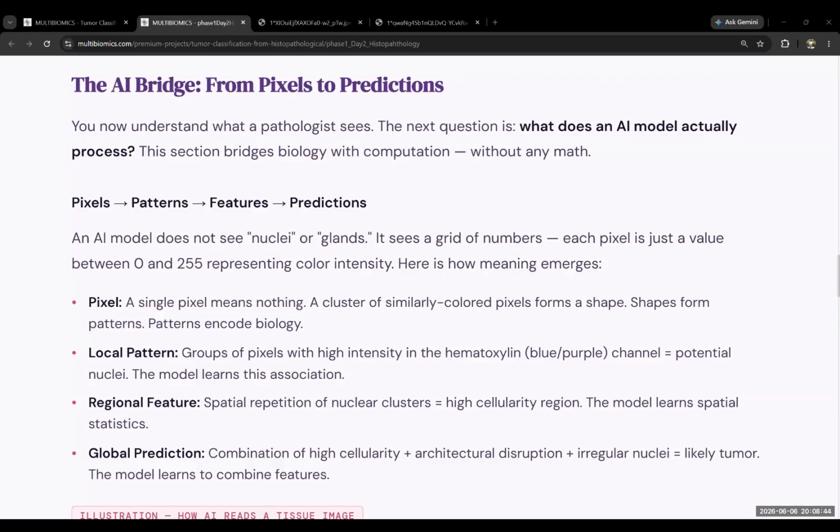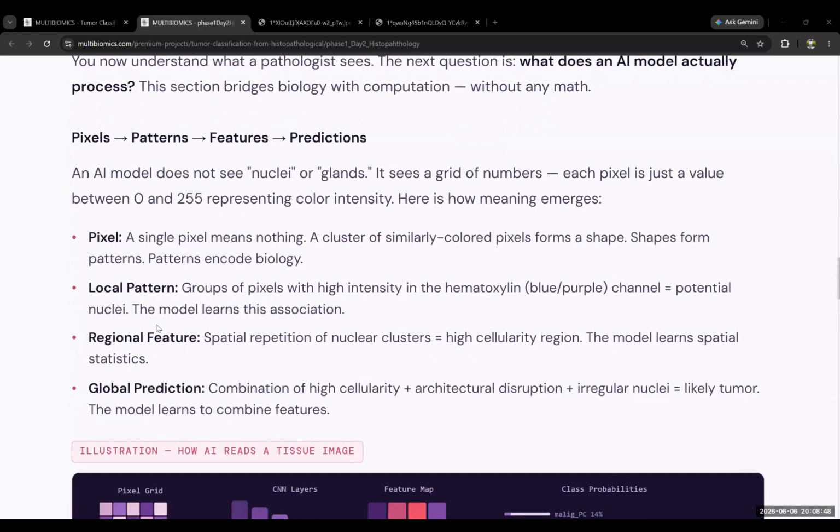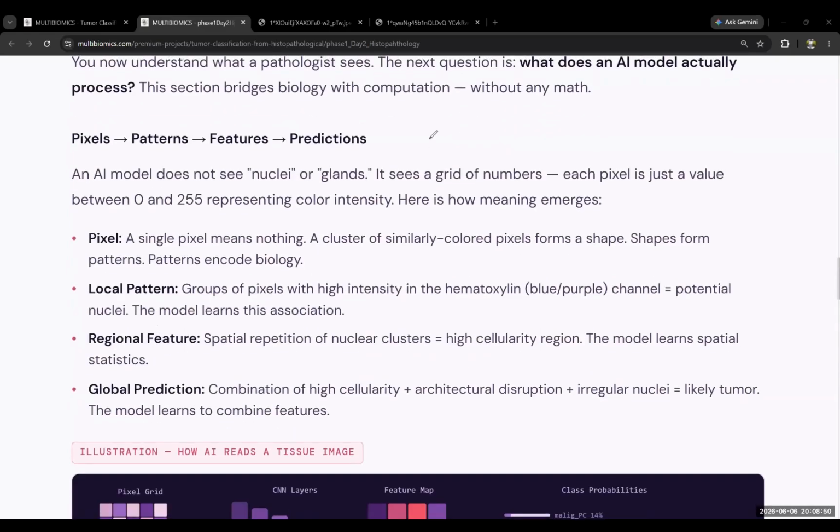Okay, I'll stop share and I'll share my website page again. I hope you got a little bit of understanding of those 3 channels that we'll be dealing with later on. Each pixel will have 3 channels: red value, blue value, and green value. Understood? Now, each pixel is just a value between 0 to 255, and it will represent the intensity of the color.